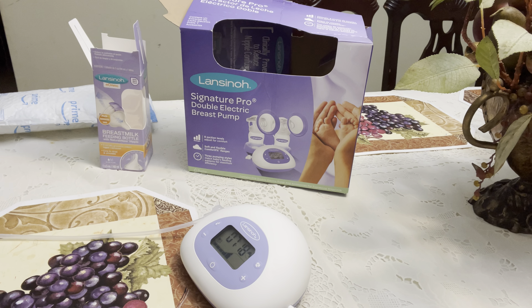With this one, that's not the case. Let's see how much I can get within the next three minutes. The first time around I used this breast pump for a week as a new mom and after that I nearly threw it away — I literally put it in the trash, it frustrated me so bad. That's when the Spectra 2 breast pump came and I used that for six to seven months before switching to the Motif Luna for a few months, then switched back to the Spectra 2 for its features.